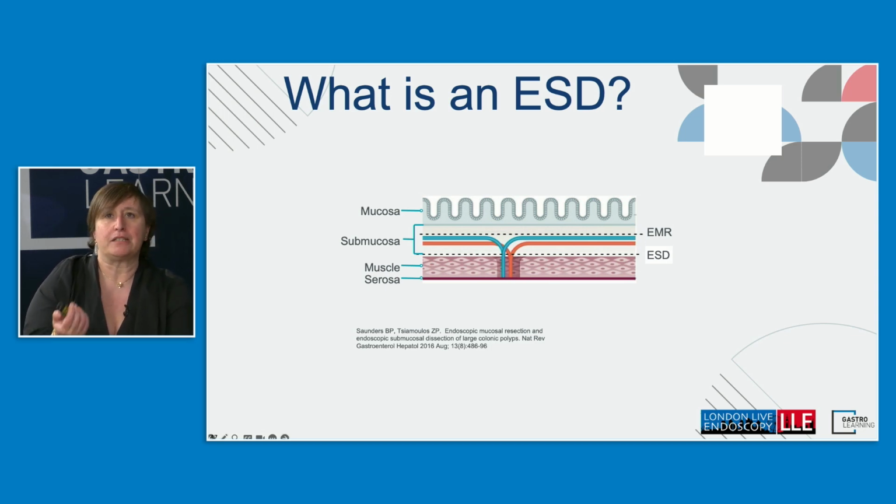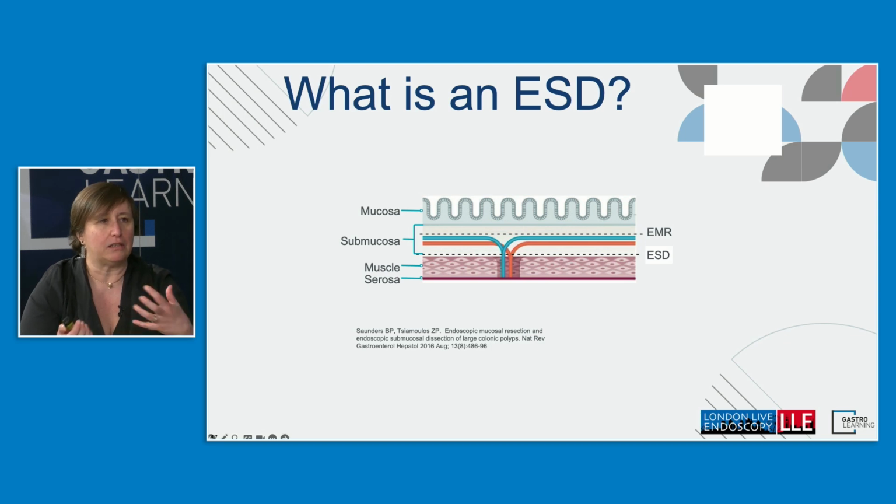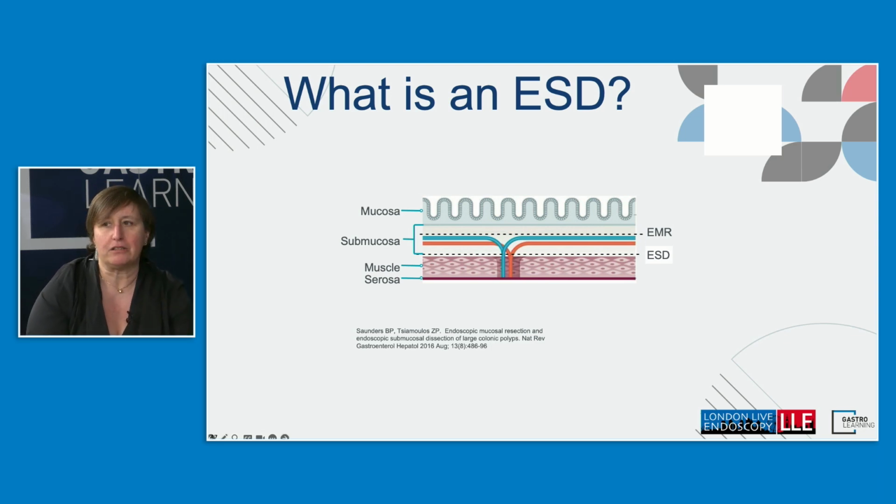And you are going to see a video of a 2.5 hour ESD that I've done, and the very difficult task was to try to condense it to just over 15 minutes. And sometimes if you are not familiarized with ESDs, it's a bit difficult to follow the script of the movie. So these are very simple vignettes that I'm going to give you now to highlight the different points of the video that we have.